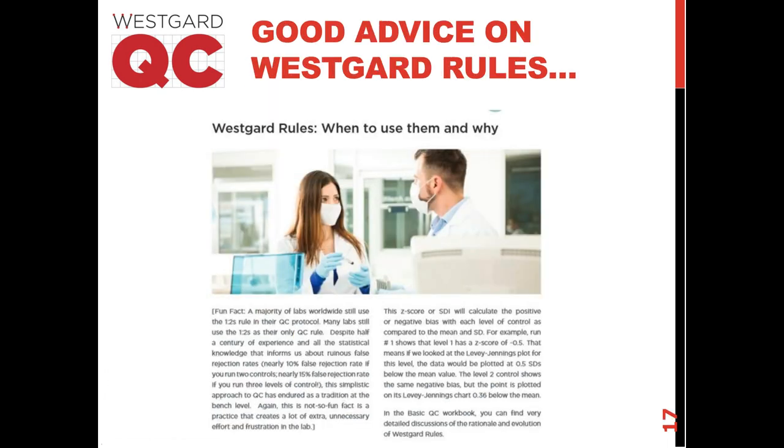So it's a good tool. But if you're using all the Westgard rules on all your tests, that might be overkill. That might be too many Westgard rules. And we're at a stage where we need to think about when we should use Westgard rules and how many of them. And we should not just use Westgard rules as a default. We want to use Westgard rules when they are necessary, but not when they're unnecessary. And of course, then the question arises, well, how do you know when you need Westgard rules?